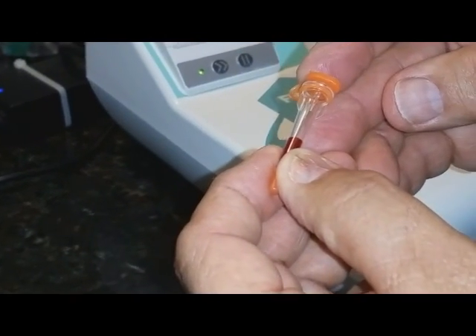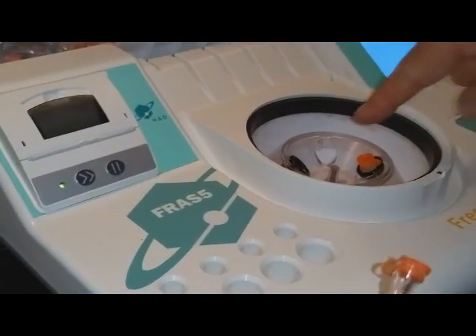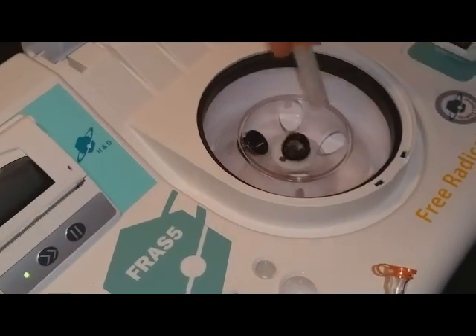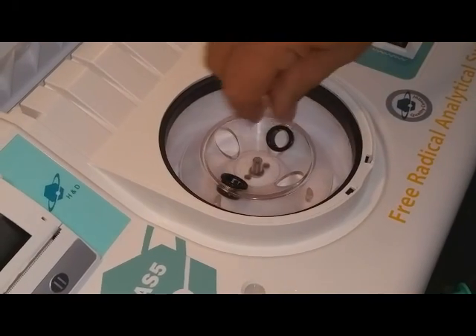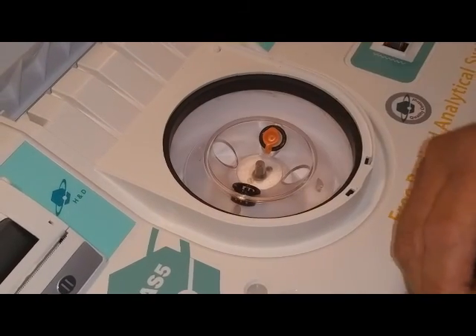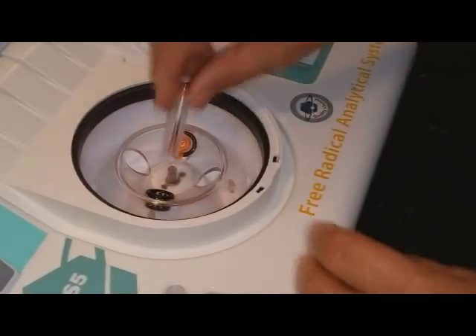We're going to take our blood sample. Now I'm closing the cap and opening the centrifuge. Notice the balancing tube is on the opposite side from the tube we're going to use. Make sure this goes in the secondary tube and then into the centrifuge.